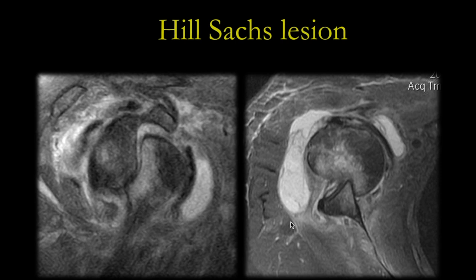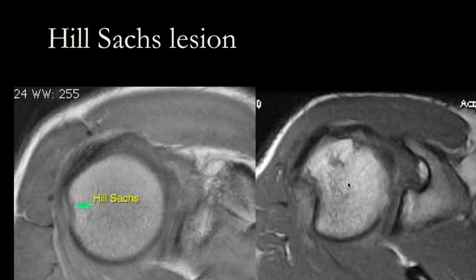This was a patient scanned while the shoulder was in anterior dislocation. As you can see, the shoulder is dislocated anteriorly — the labrum here is torn, and you can see the glenoid impacting into the humeral head. This results in an impaction fracture along the posterior superior humeral head, which is the Hill-Sachs lesion.